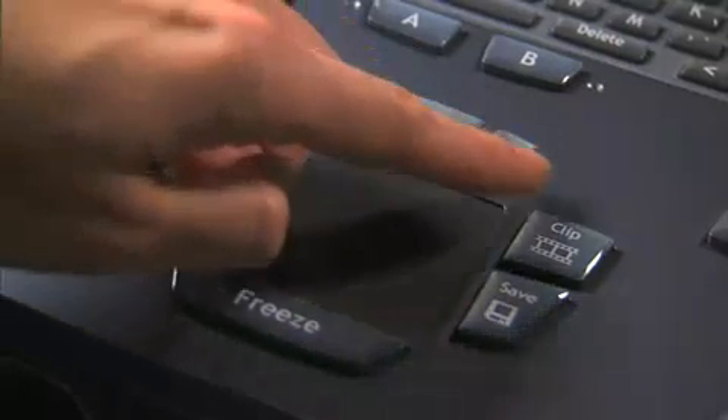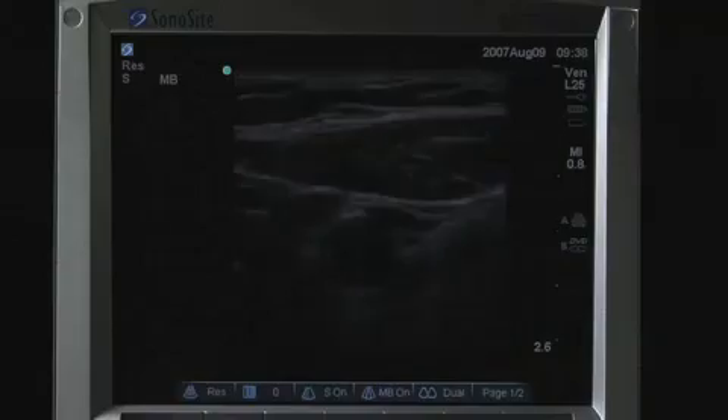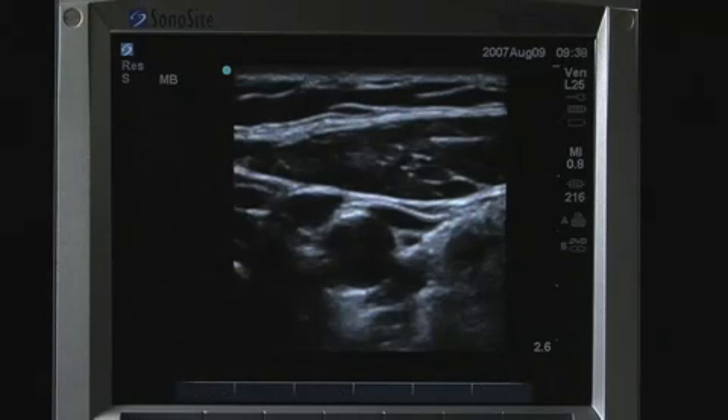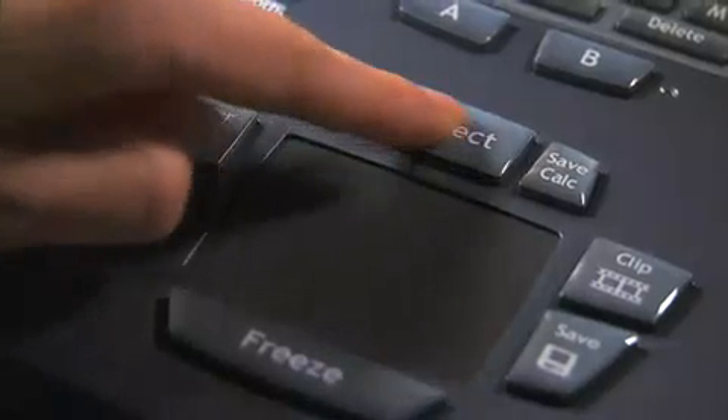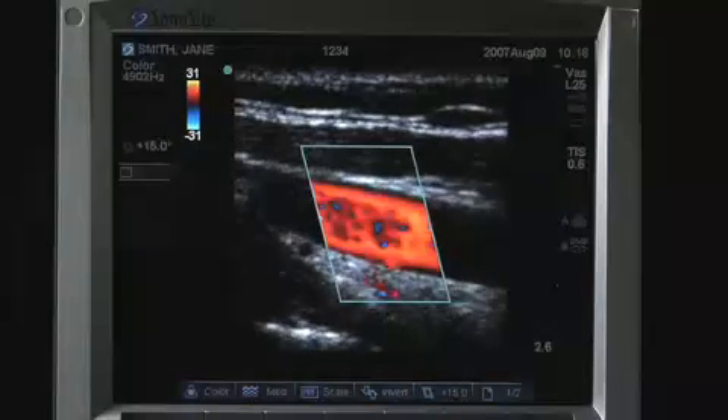Surrounding the touchpad are the system controls used most frequently. The Freeze button stops live imaging and displays a frozen image. The Select key is used to make various choices depending on the function activated — it is used to switch between calipers for measurement and selections on color and Doppler menus.